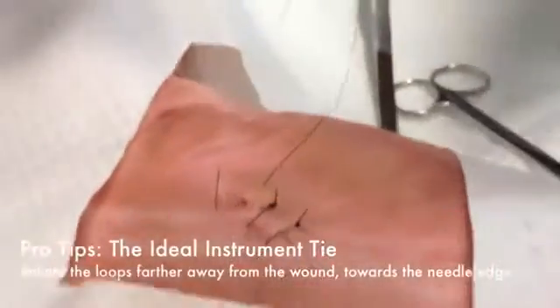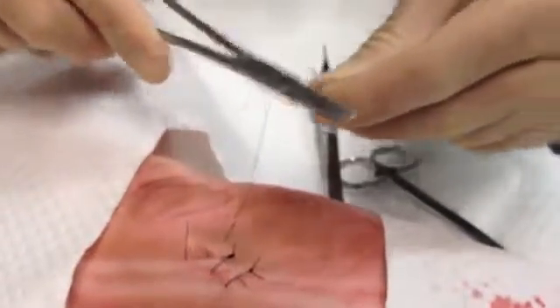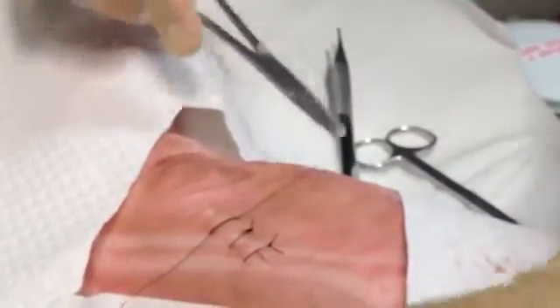Now let's focus on some of the pro tips for the instrument tie. I like to try and tie far away from where I'm going to actually be landing the suture. And the reason for this is you're less likely to pull up on the knot this way.